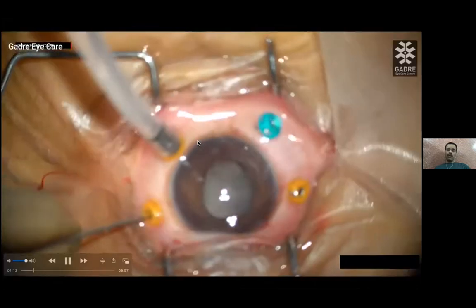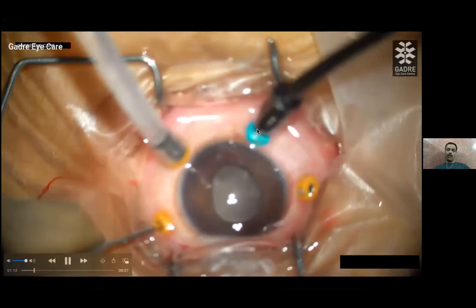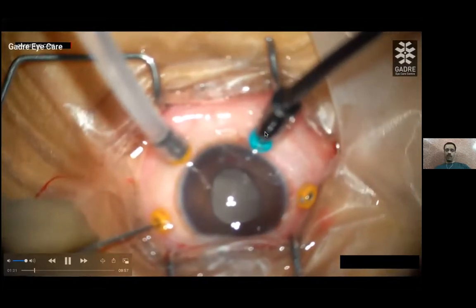So I decided to proceed with the surgery, cut that stalk of vitreous that was there, and inserted a chandelier light in a 25 gauge sclerotomy port inferiorly, since a bimanual approach will be required. I decided to follow the vitreous stalk hand over hand so as to try to reach the disc. This is me searching for any subretinal membranes, since this would be the best time to remove them. I had 360-degree access, but unfortunately they were just retinal convolutions. There were no obvious subretinal membranes.